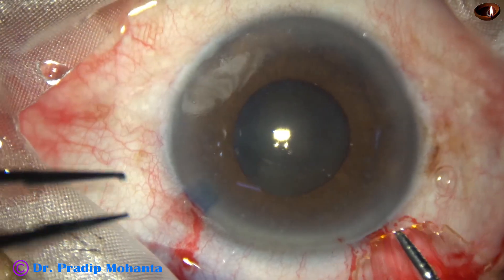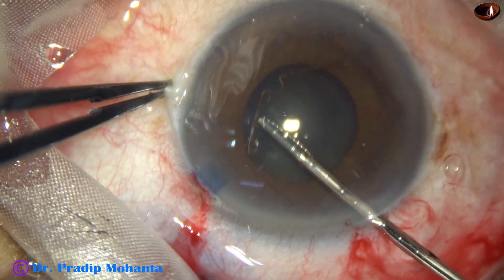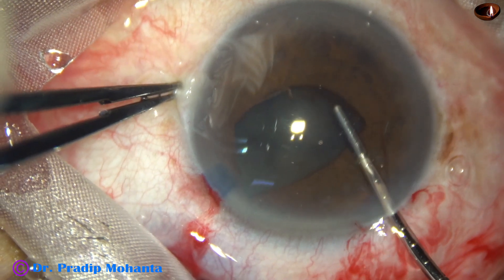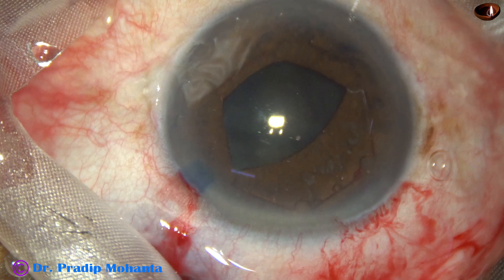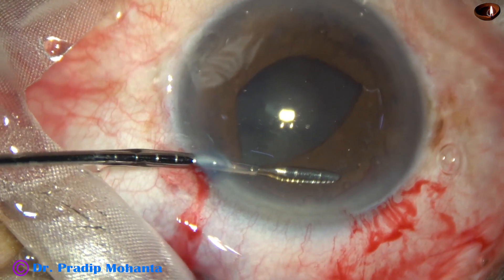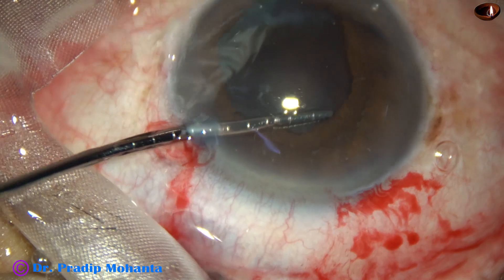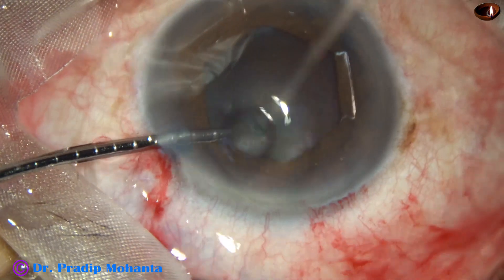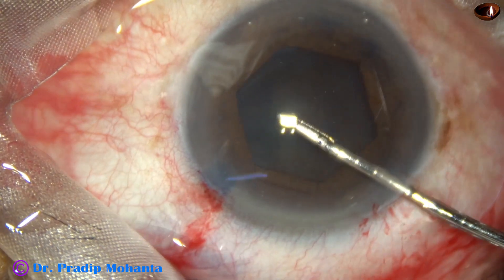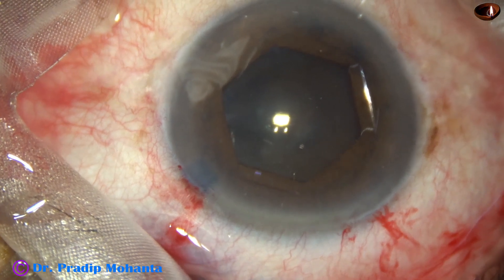My plan is to use a pupil expansion device — the B-hex, which stands for Bhattacharji hexagonal, invented by Dr. Subhan Bhattacharji. It is a hexagonal pupil expansion device, no joint, made of polyamide. I tuck the flange at 1 o'clock first through the main incision, then the flange directed at 7 o'clock. Then through the side port, the remaining flange is tucked. Three flanges are behind the iris, three above — a uniplanar device. The pupil has now taken a hexagonal shape, approximately 5.5 millimeters.